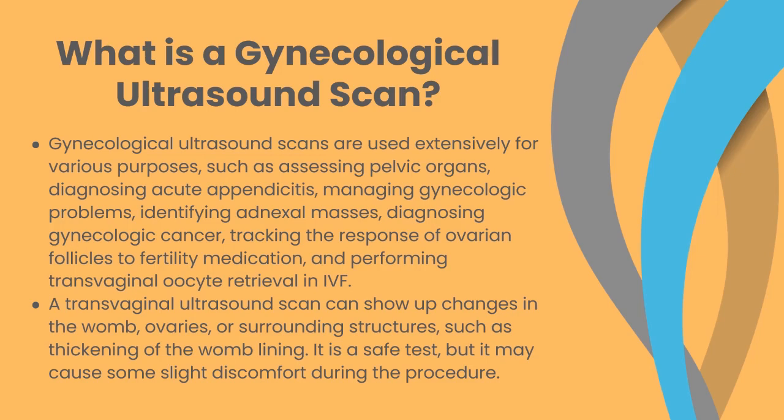Gynecological ultrasound scans are used extensively for various purposes, such as assessing pelvic organs, diagnosing acute appendicitis, managing gynecologic problems, identifying adnexal masses, diagnosing gynecologic cancer, tracking the response of ovarian follicles to fertility medication, and performing transvaginal oocyte retrieval in IVF. A transvaginal ultrasound scan can show up changes in the womb, ovaries, and surrounding structures, such as thickening of the womb lining. It is a safe test, but it may cause some slight discomfort during the procedure.